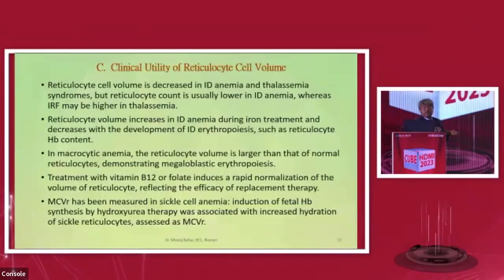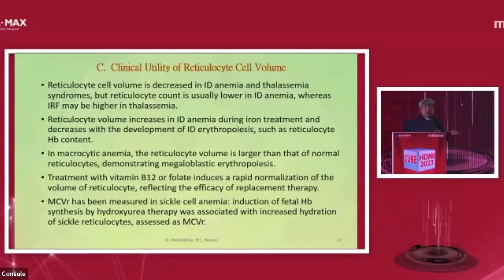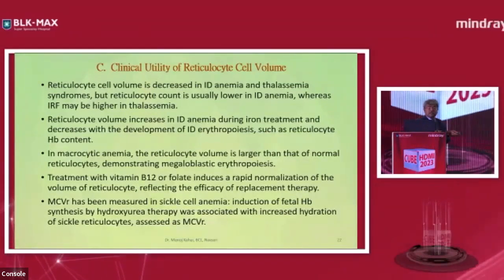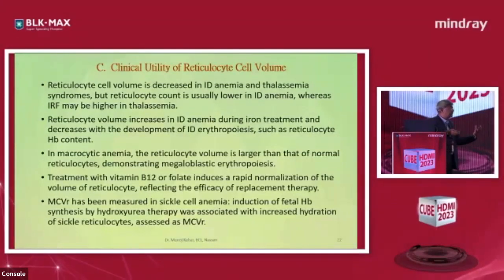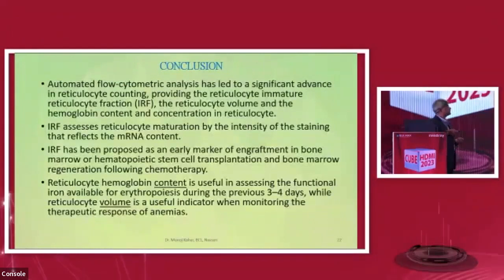MCVR, the mean cell volume of reticulocytes, has been measured in sickle cell anemia. Induction of fetal hemoglobin synthesis by hydroxyurea therapy was associated with increased hydration of sickle reticulocytes as assessed by MCVR. So when you start hydroxyurea therapy, the reticulocytes will be increasing in size.